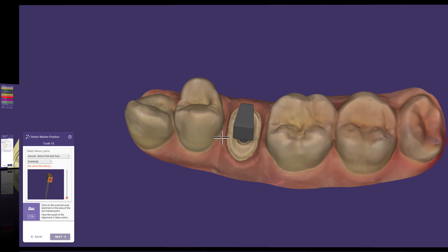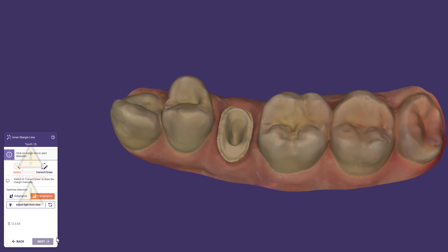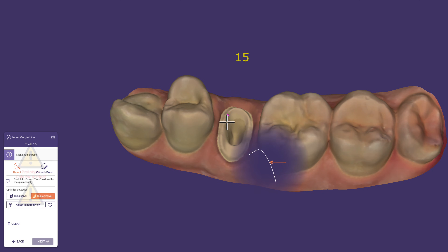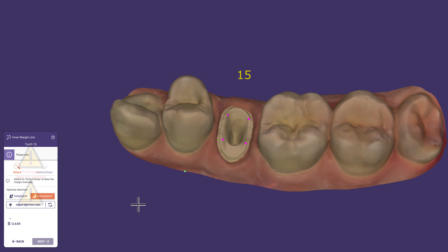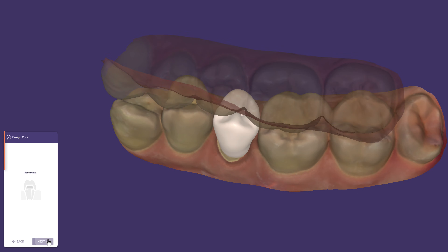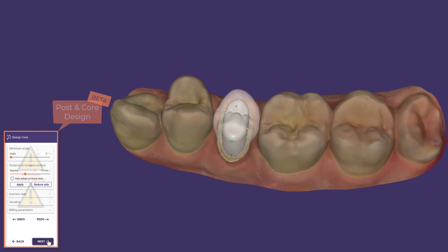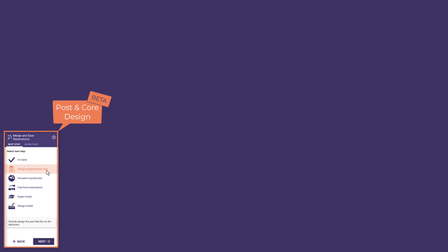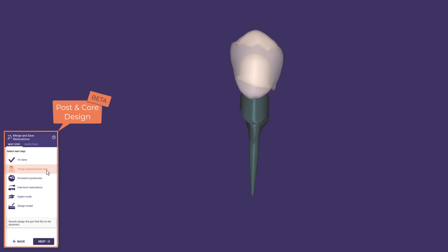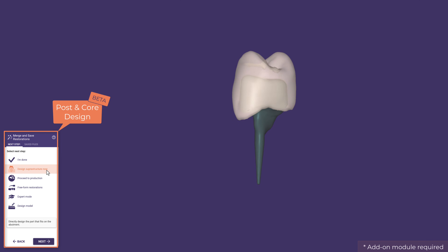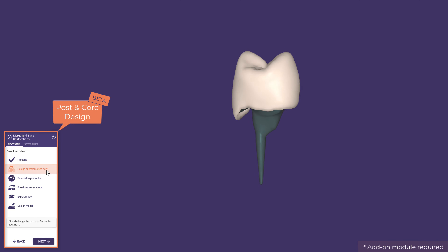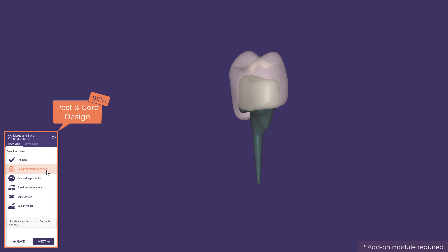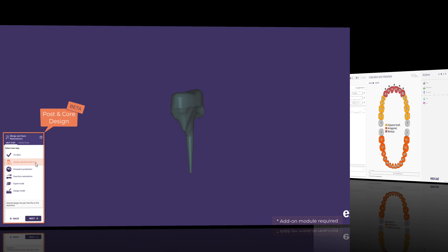With 3.2 Alicina, you can design post and core and the matching crown within a wizard workflow. Based on the designed anatomy, the new feature helps you generate post and core for fast and functional root channel treatment, as well as the final restoration in one combined workflow. This feature is available for early prototype testing upon request and requires a separate module activation.